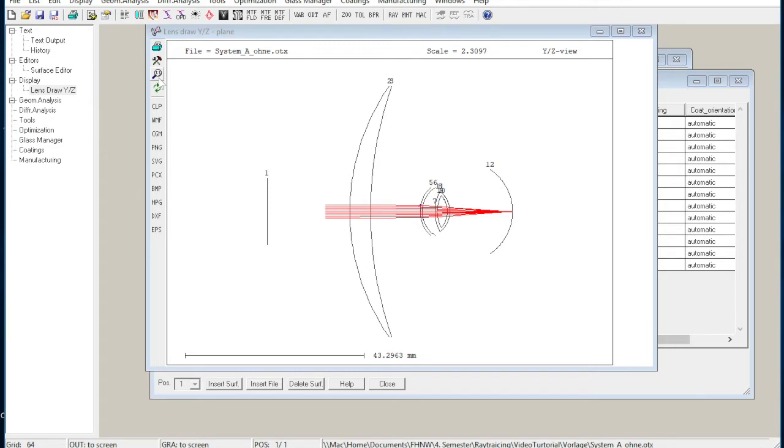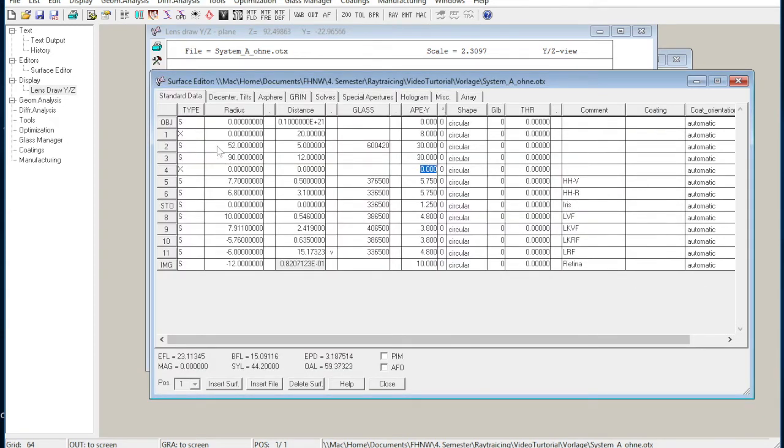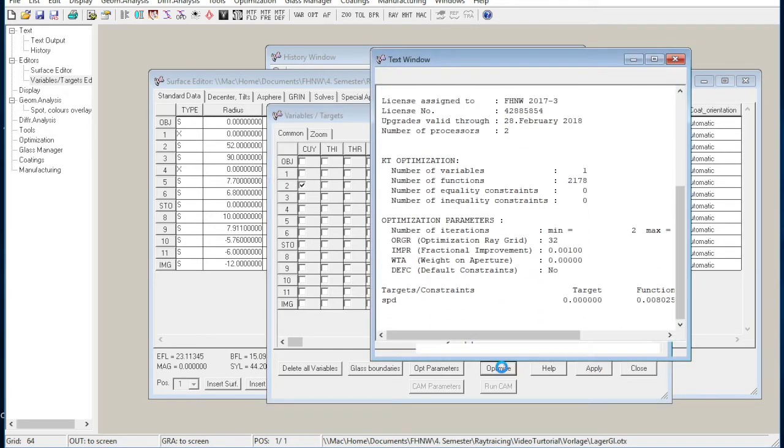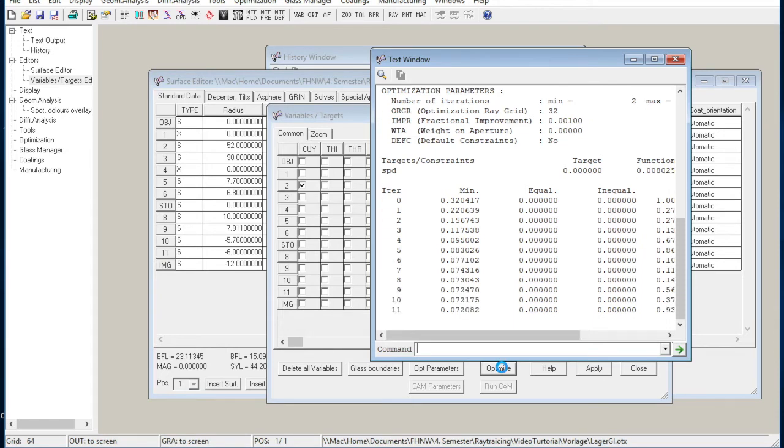One way is to optimize a surface. So we'll show you how to optimize a surface here in Optalix. We're going to optimize the first surface, so just click on the button VAR, and there you can optimize the radius, thickness, distances, etc. We select the radius from the front surface, which is number 2. Then we type SPD, click on Apply, and then Optimize.